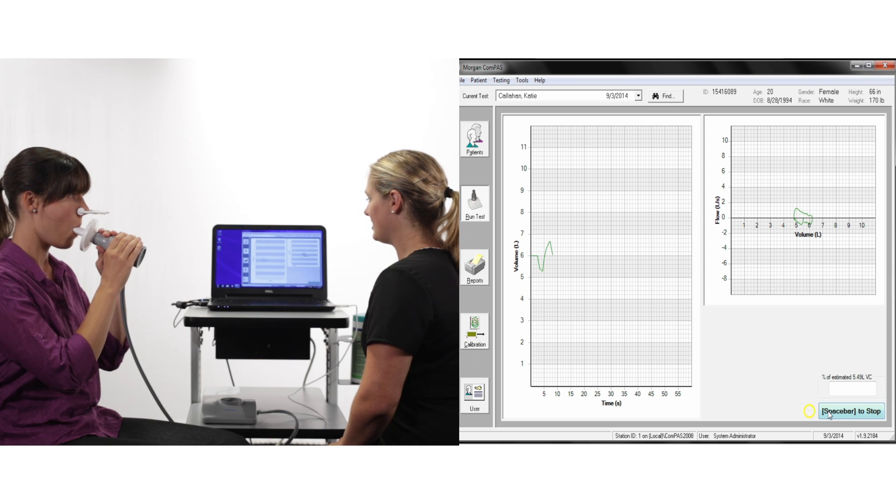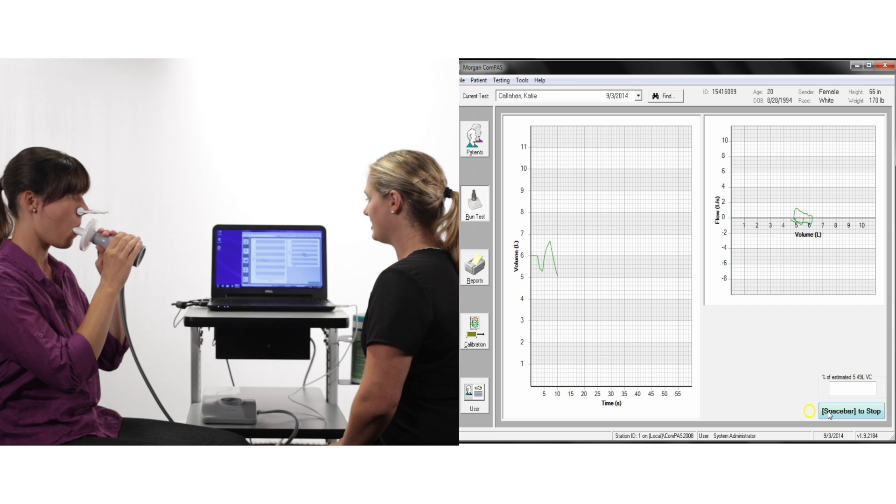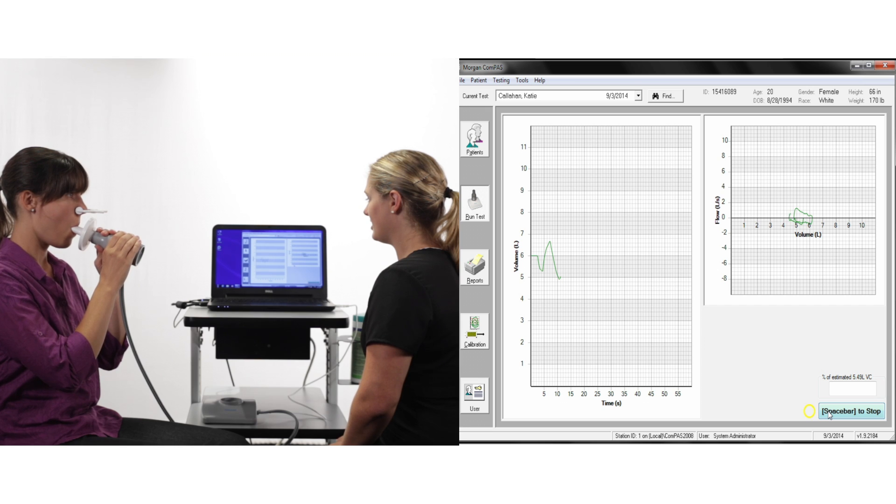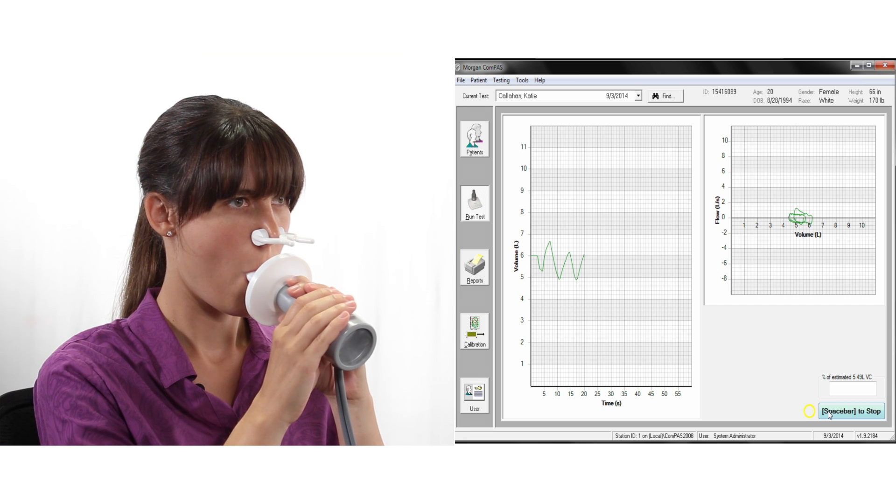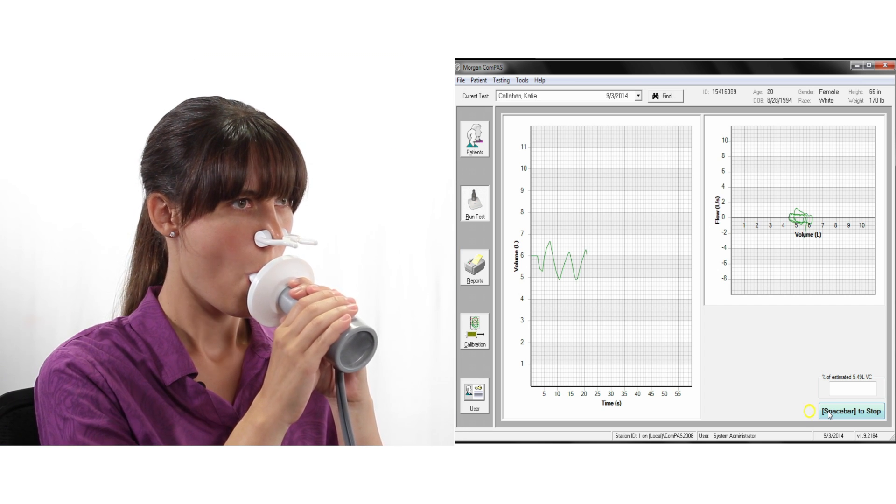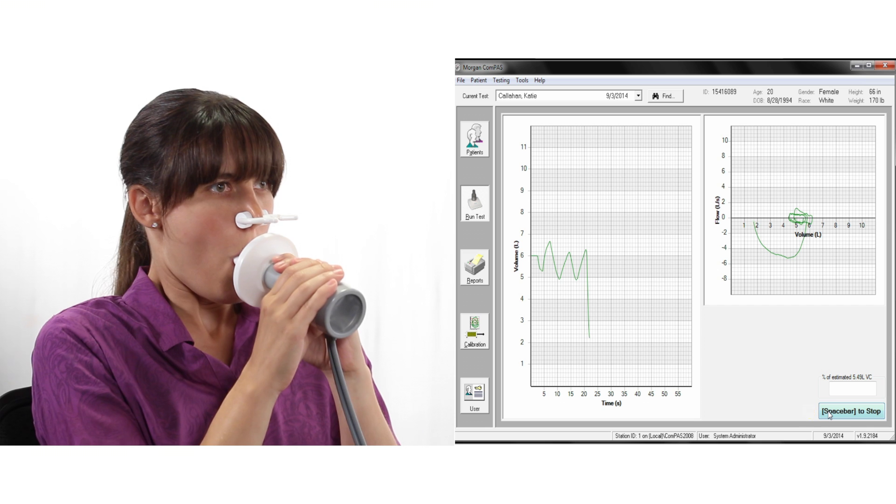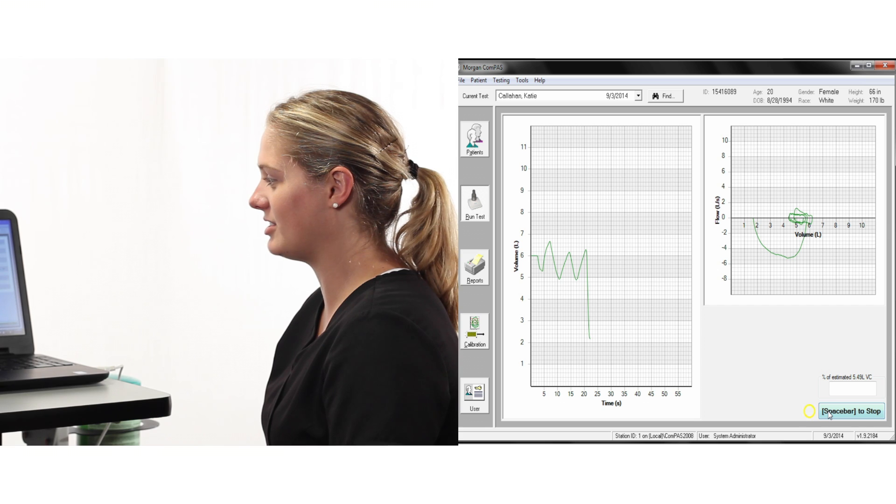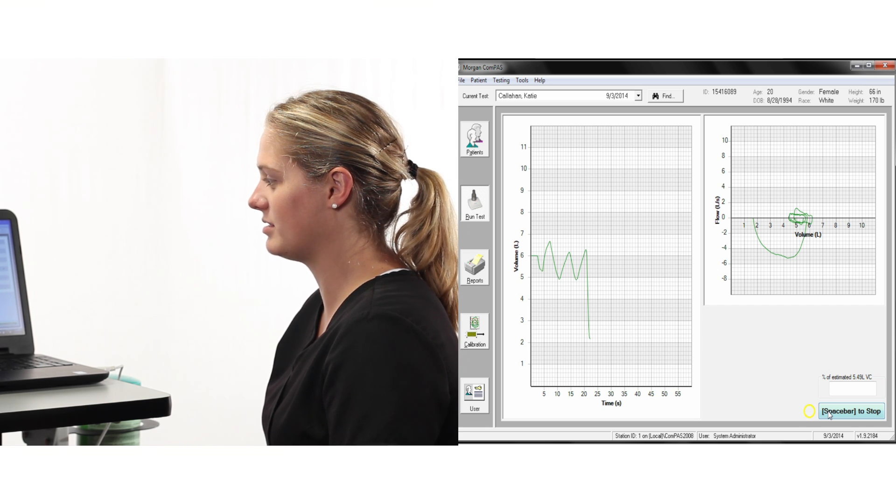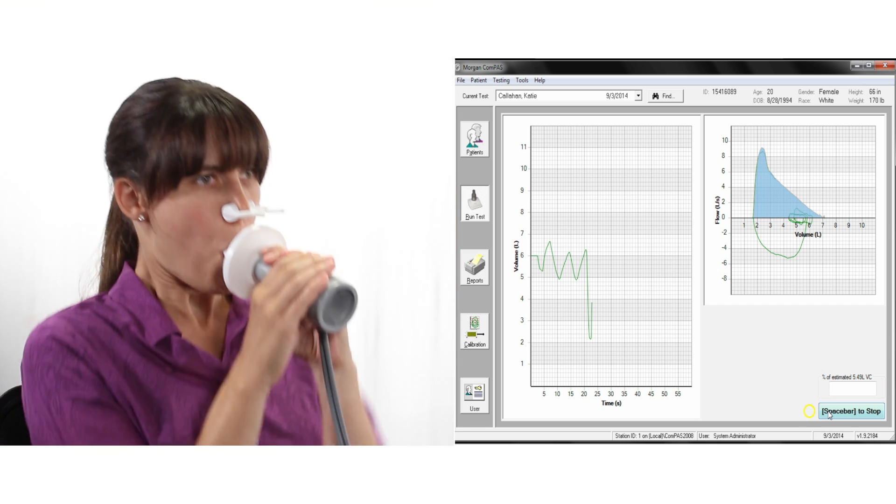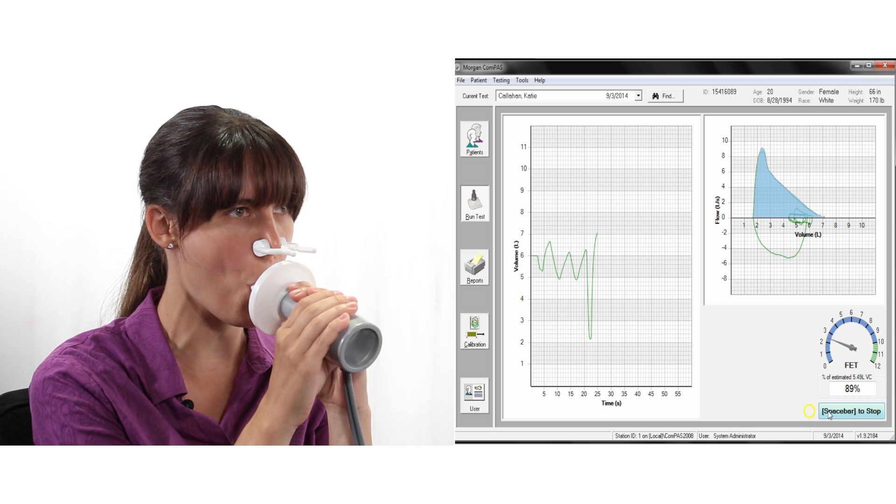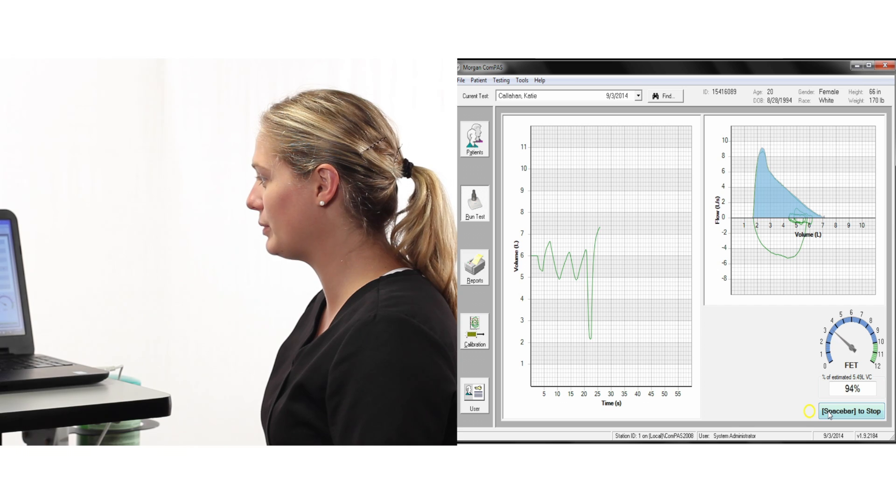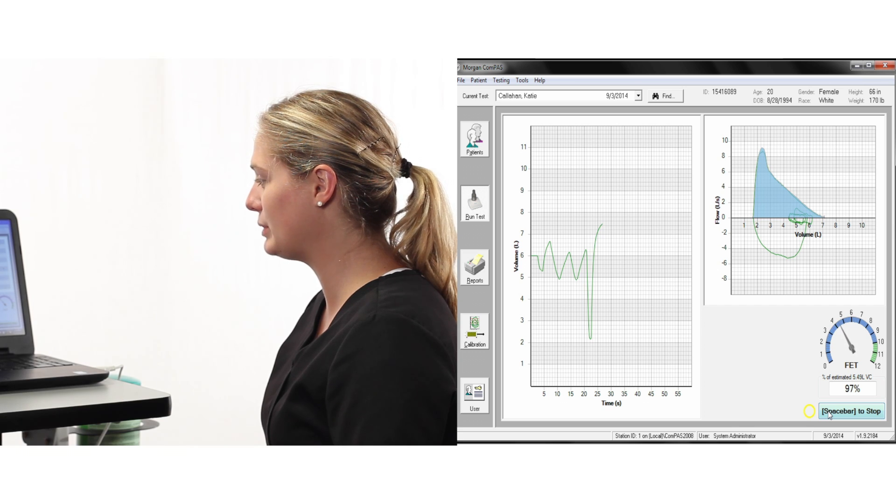Once you see a stable tidal volume, ask the patient to take a deep breath in as far as they can, make sure they are fully inflated, then encourage them to blast the air out as hard and fast as they can and continue the effort until they are completely empty.